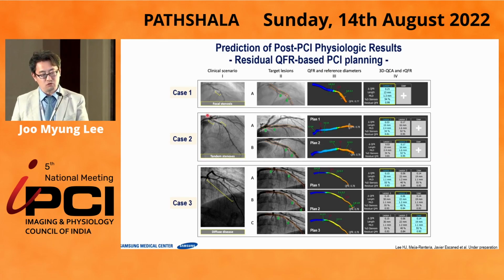And the clinical usefulness of residual QFR is you can design your procedure before the PCI. So we can do the virtual PCI using this console, and we'll get the residual QFR, and based on that, you can decide your treatment plan.